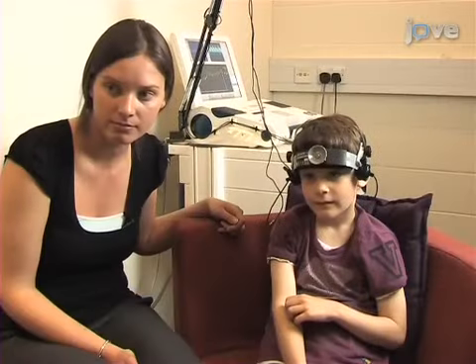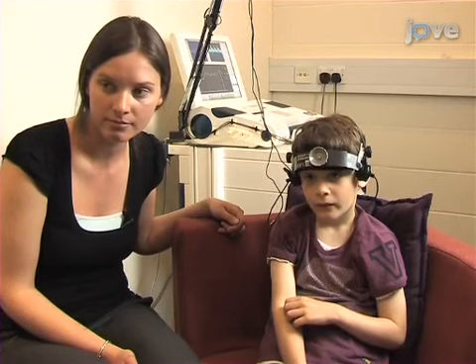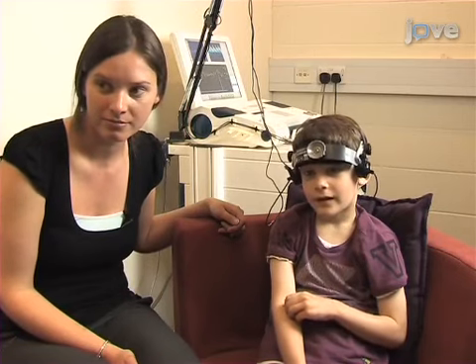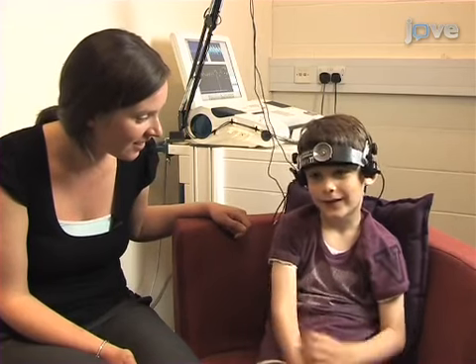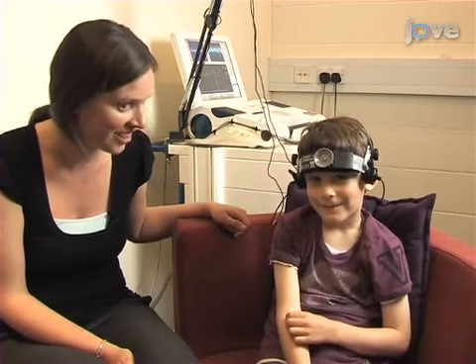Start the recording devices and begin the trial. Testing works best if one experimenter is responsible for keeping the child on task and recording what they say. What happened in that one? He put his scarf and hat on and went outside. Very good. And what colour was his hat and scarf? Red. Very good, well done.